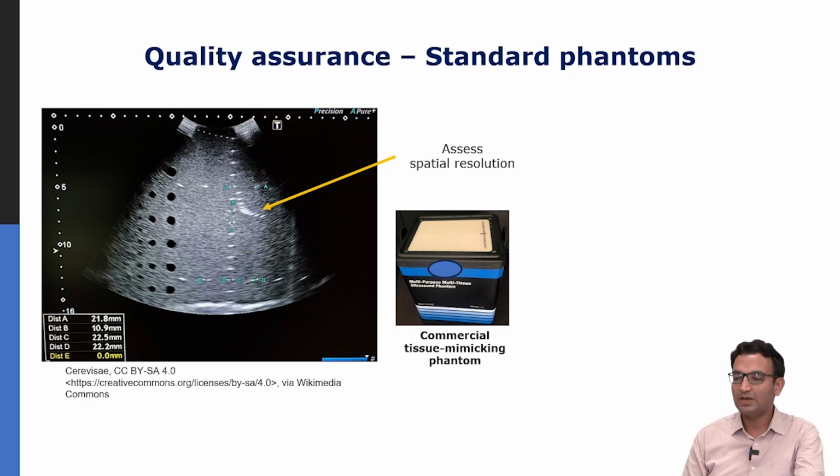So in this manner, we are able to perform quality assurance and you are also able to take these points, measure the widths, and get the point spread function of the ultrasound imaging system. As I said, the point spread function in general will be depth dependent or spatially dependent. From the point spread function, you can calculate the main lobe width, the axial width, the lateral width. Also, you can measure the side lobe level. That will tell you a lot of things about the imaging system.